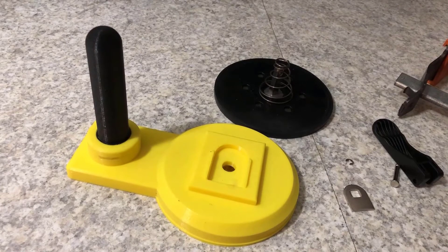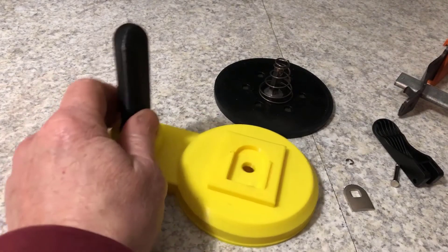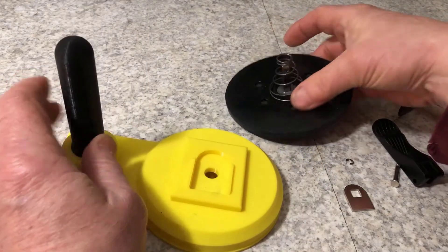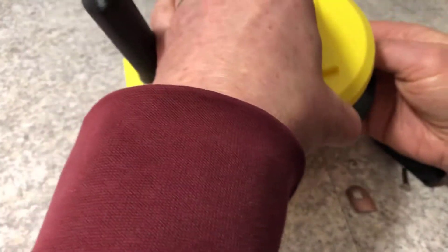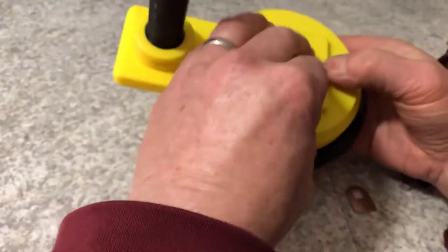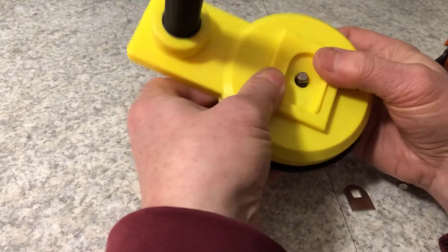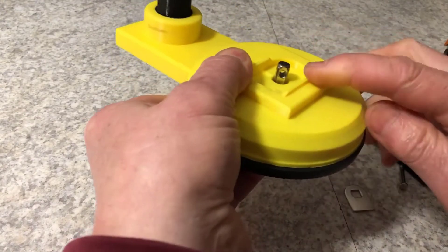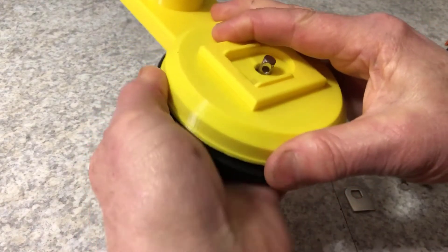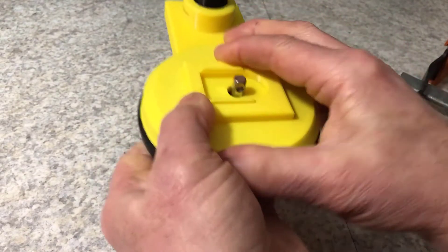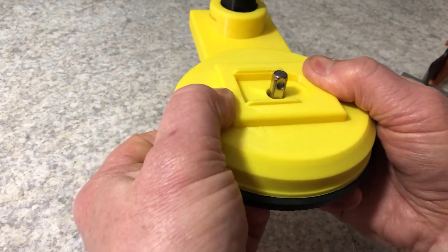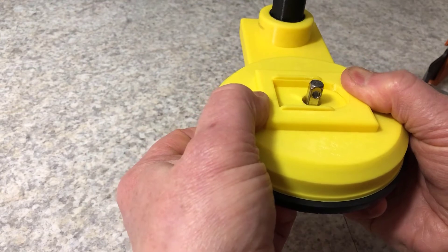So to reassemble, we take our base and we're going to take the suction cup assembly and fit that through the hole. Something to be careful of is that we want to make sure that we rotate our suction cup assembly so the hole is similarly placed.